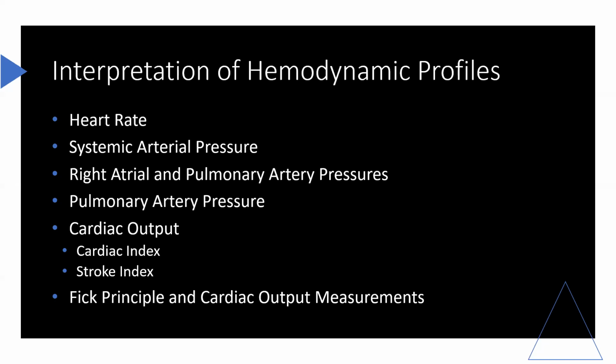In many cases, the cardiac output and the stroke volume may be reported relative to the person's body surface area, which can be easily obtained using a Dubois chart like the one that could be found in your textbook. This indexing technique allows the clinician to compare an individual's cardiac output or stroke volume with that of normal healthy individuals of the same weight and height.